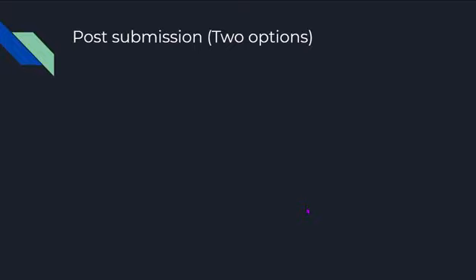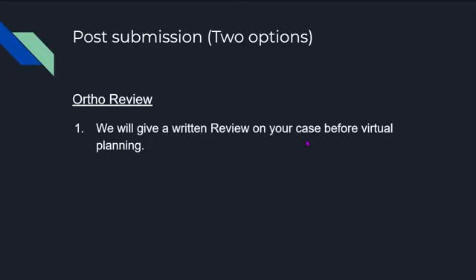Okay, so post-submission. After you've submitted the case, what are you going to get back? It's good to note what you can expect. You can expect an ortho review. This is one of the two options. So what is an ortho review? An ortho review is a written review on your case before actually doing the full virtual treatment plan.